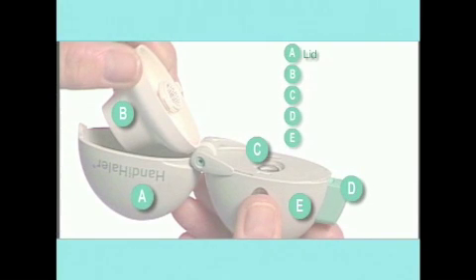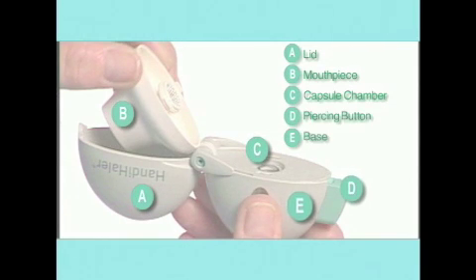This diagram shows the different parts of the Handihaler: the lid, mouthpiece, capsule chamber, piercing button, and base.